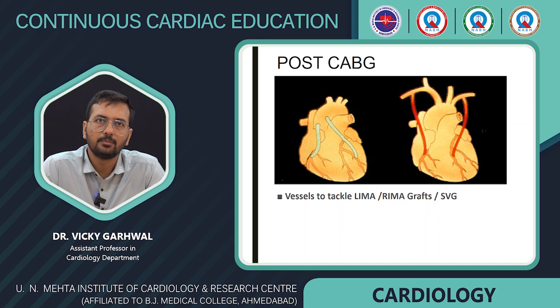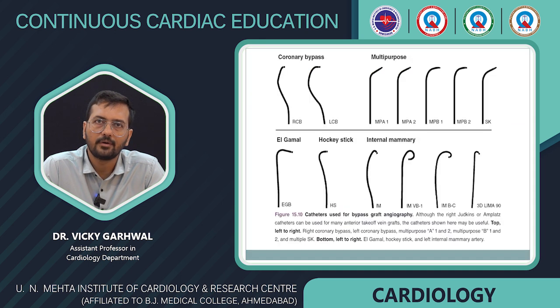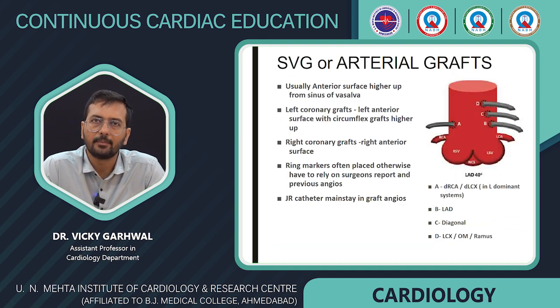Coming to the post-CABG patient, we have to tackle the Lima grafts and venous grafts. Commonly used catheters for the bypass graft are JR catheters, coronary bypass catheters, multi-purpose catheters, MPA 1 and 2, and AL catheters, hockey stick, and various internal mammary catheters.